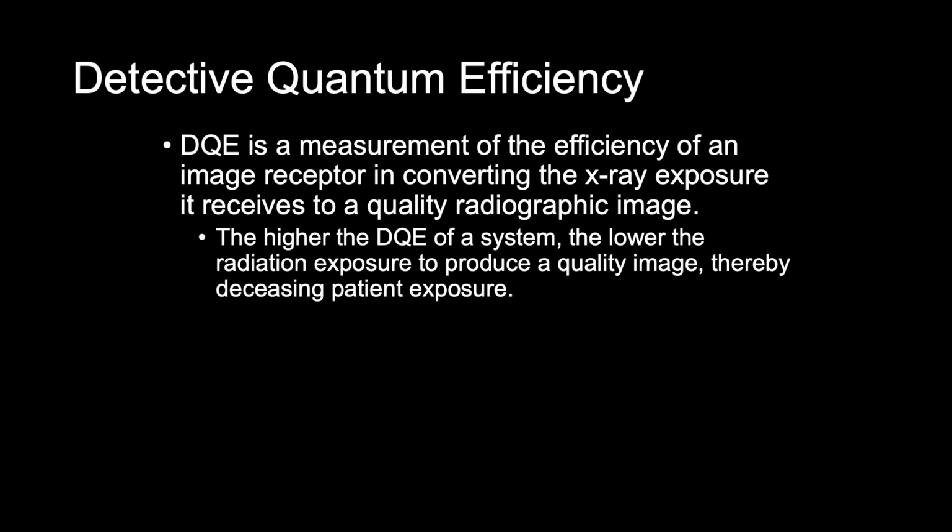Detective quantum efficiency, or DQE, is a measurement of the efficiency of an image receptor in converting the X-ray exposure it receives to a quality radiographic image. The higher the DQE of a system, the lower the radiation exposure to produce a quality image, thereby decreasing patient dose. So again, the image receptor with higher DQE requires less X-ray exposure to produce an image as compared to an IR with a low DQE.